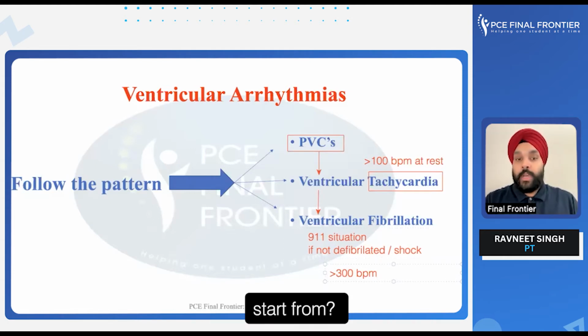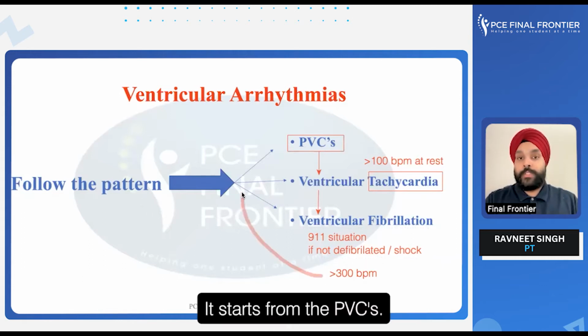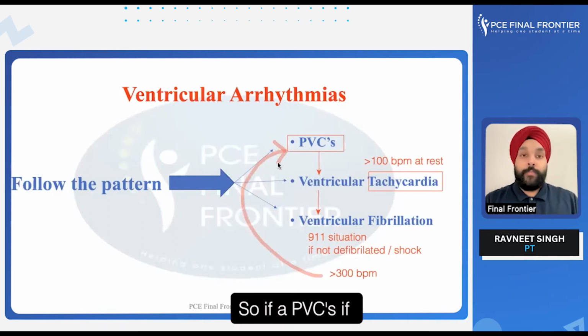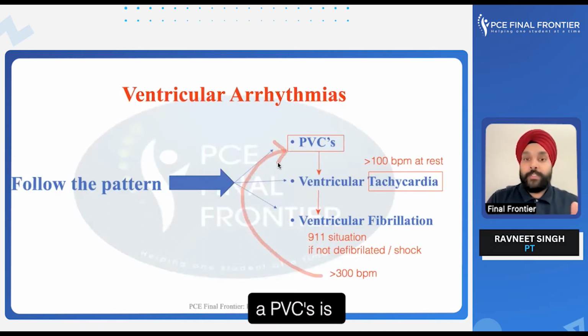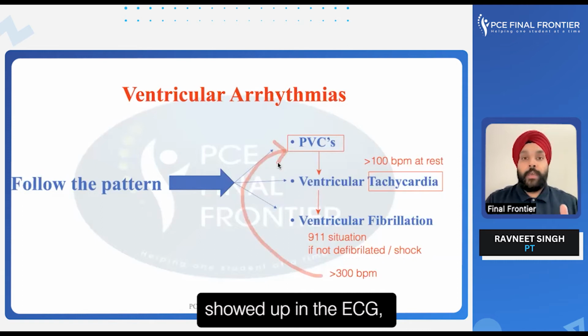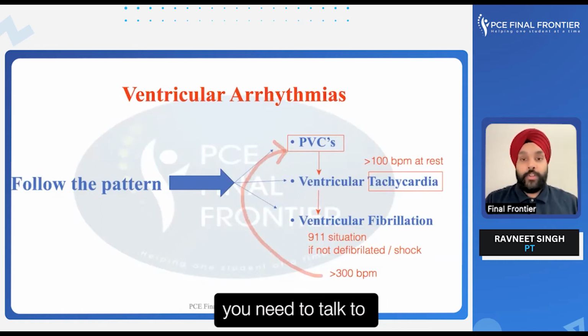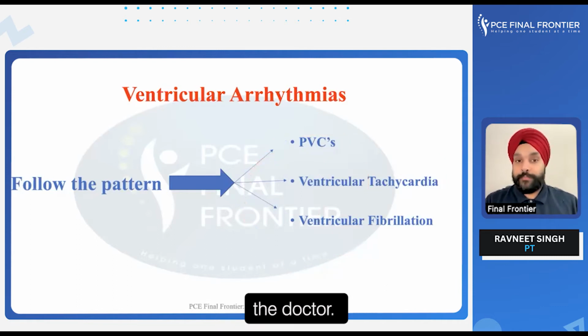Where did everything start from? It starts from the PVCs. So if a PVC shows up in the ECG, then if it's worrisome or if it's frequent, you need to talk to the doctor.